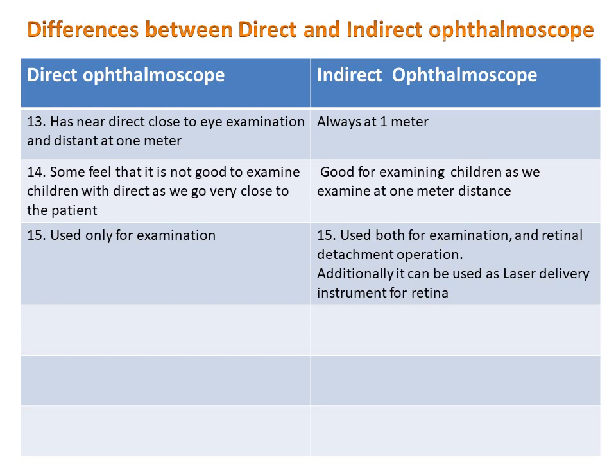Final difference between the direct ophthalmoscope and the indirect ophthalmoscope is that direct ophthalmoscope is used only for examination of the patient, and no therapeutic benefits are there by using direct ophthalmoscope. It is basically for examining the posterior segment, and it's for examination only. That is not the case in case of indirect ophthalmoscope. It is used not only for diagnosis of various retinal disorders, especially retinal detachment, and it can be used as an equipment, operating equipment in case of retinal detachment operation.